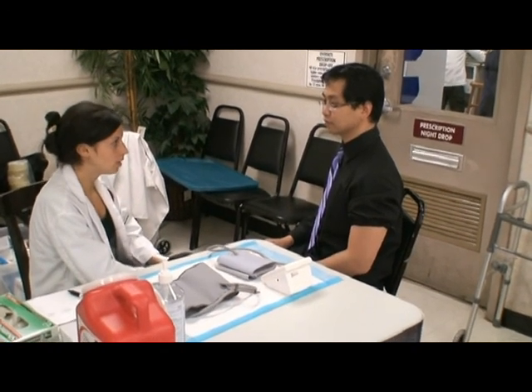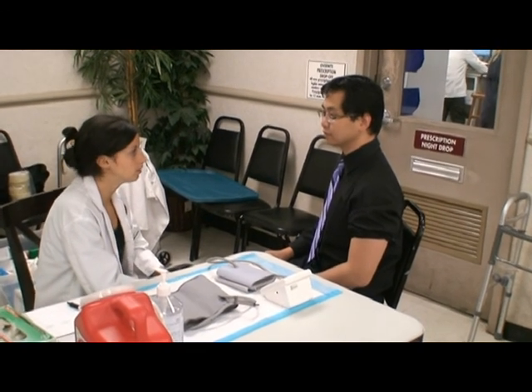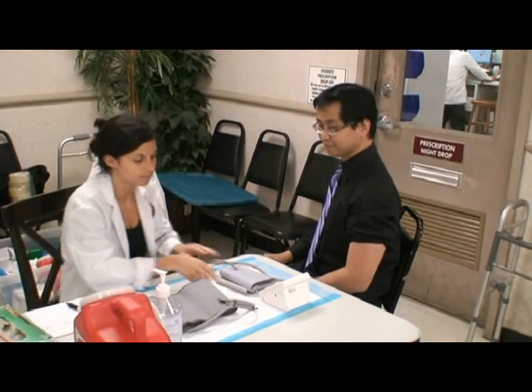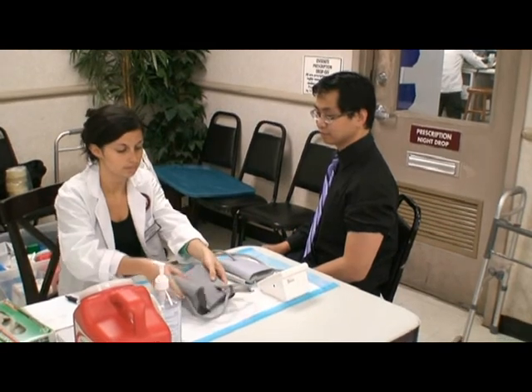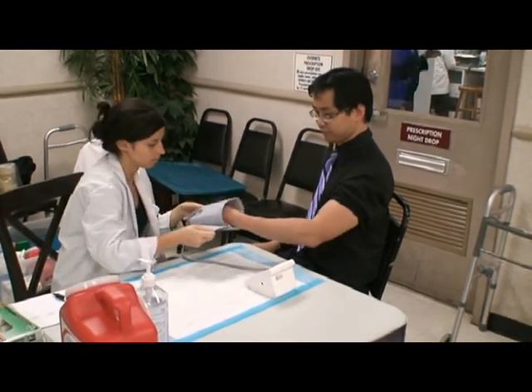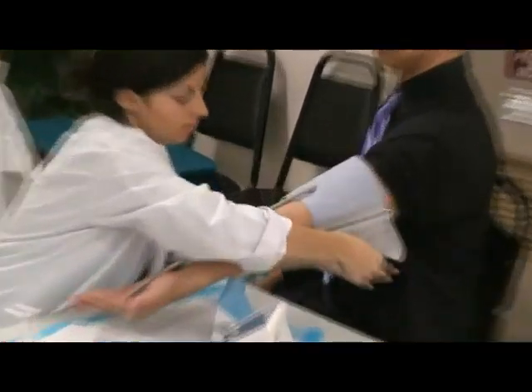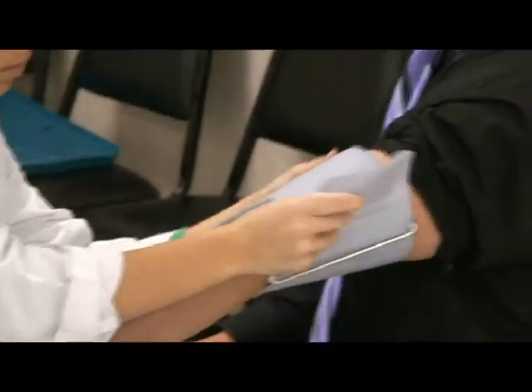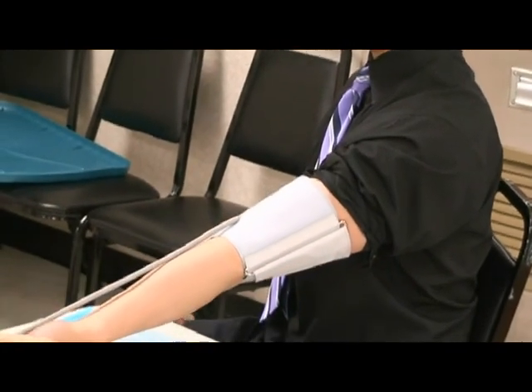Could I ask you not to talk while I take your blood pressure reading just to make sure that there's not an inaccurate result? Sure. Before beginning the test, we want to pick the right cuff size to prevent inaccurate reading. We want to align the cuff tube with the brachial artery. And we also want to make sure that the arm is also aligned with the heart. That's fine, thank you.